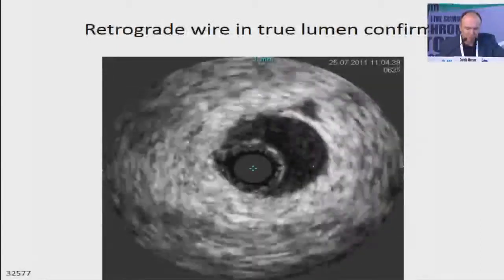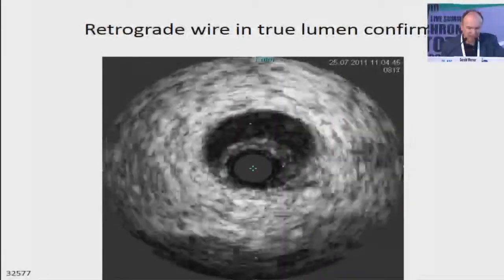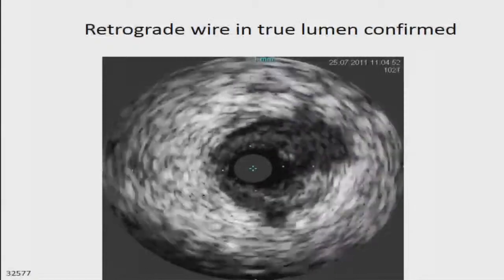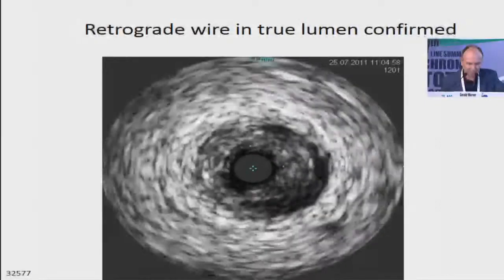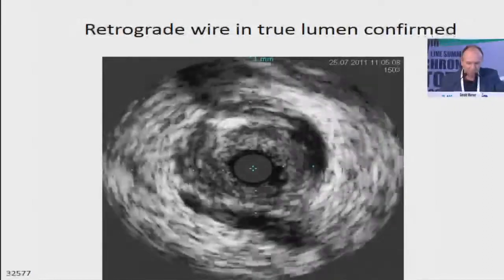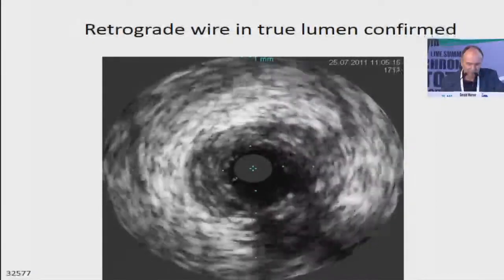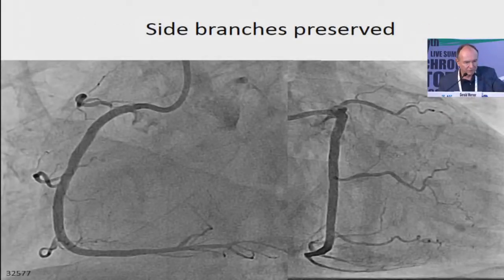I understood there was simply resistance that needed to be overcome by the wire, which was then clearly in the true lumen. When we do the review after opening and connecting, you see the retrograde wire was all true lumen, but the antegrade wire had been in a sub-intimal position and created a lot of hematoma. This is important when we put stents — we put stents just before this segment to cover the area where we have a true lumen swimming in a pool of blood, a typical feature of hematoma. This is complete restoration by proper stenting according to the IVUS image.